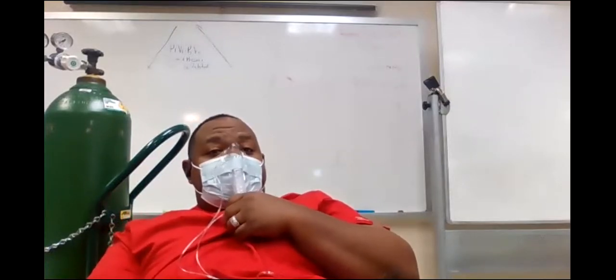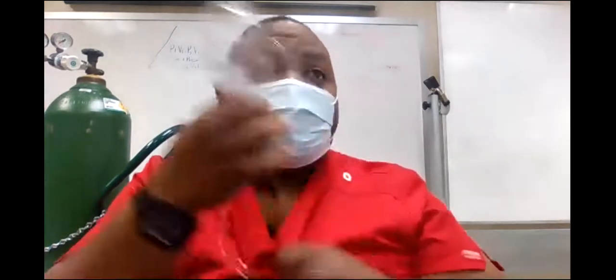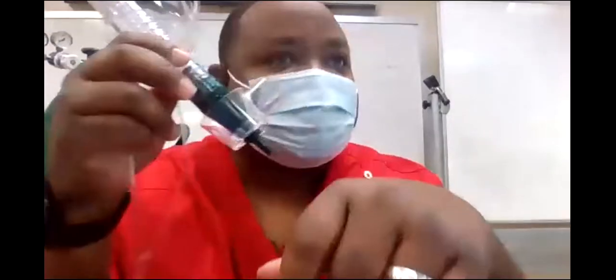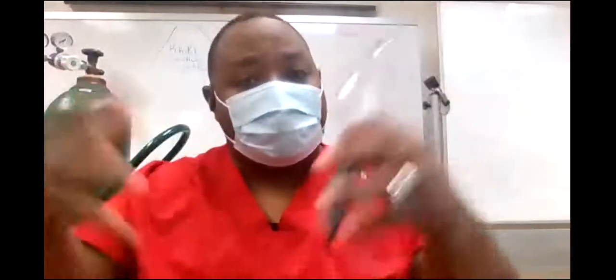Yeah, he's getting oxygen. He's getting a lot because it's covered up. So I'm covering up the windows. The windows are closed now, so he's getting pure oxygen. See what I'm saying? This thing here is supposed to help protect from bed sheets and covers. If a sheet is laying on there, it's still getting some air entrainment, okay? So it protects those windows. It protects the air entrainment. So make sure that the air is getting in like it's supposed to, okay?